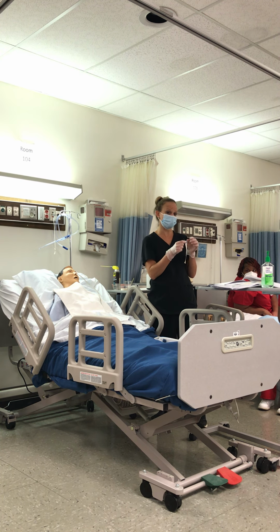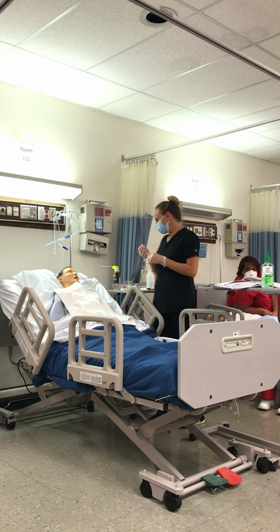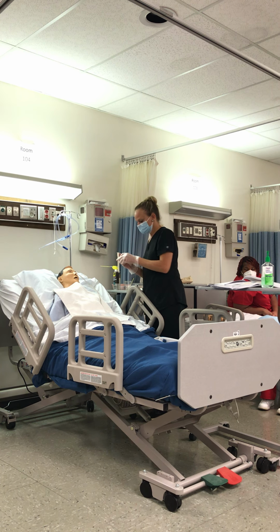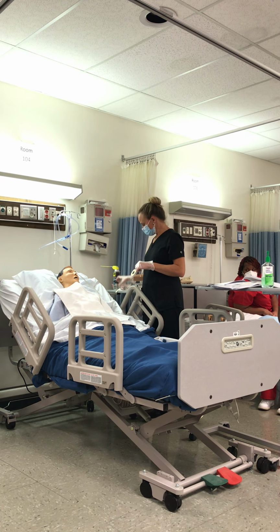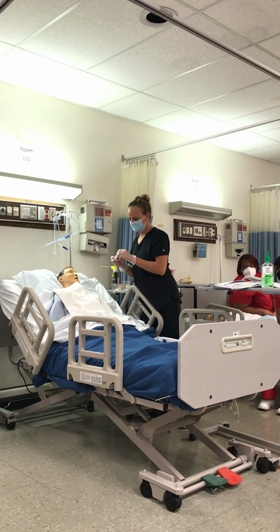Or in most hospitals, they're gonna have these little cute things that go over their nose and kind of hold it, okay? So the way to do this is to tear this tape down the middle. So you can do what? Wrap it around the nose. So this is what it would look like, okay? With one piece of tape.